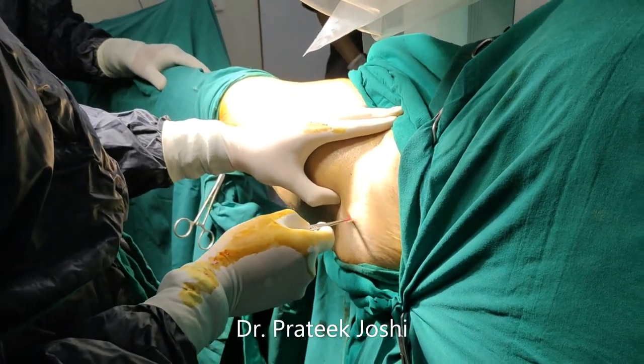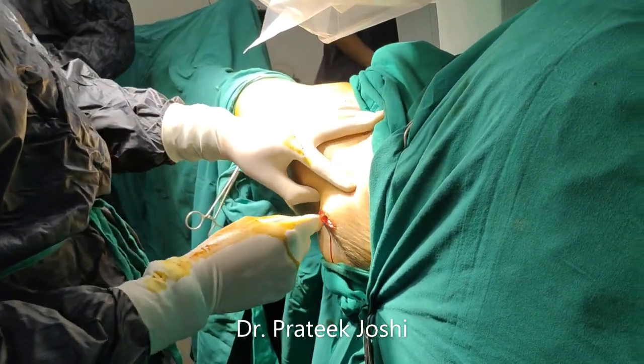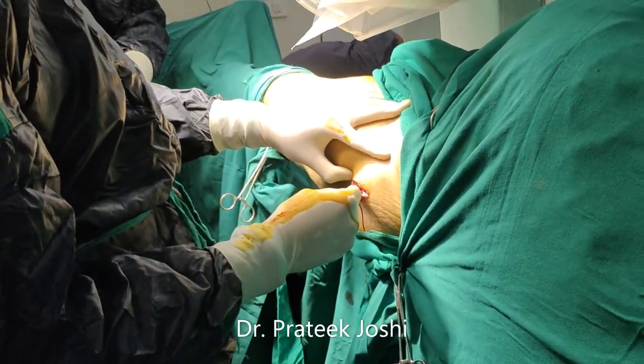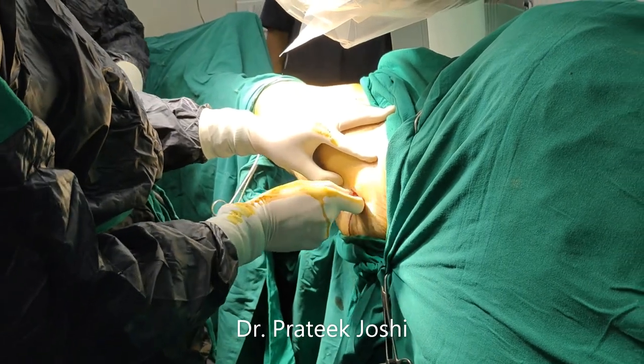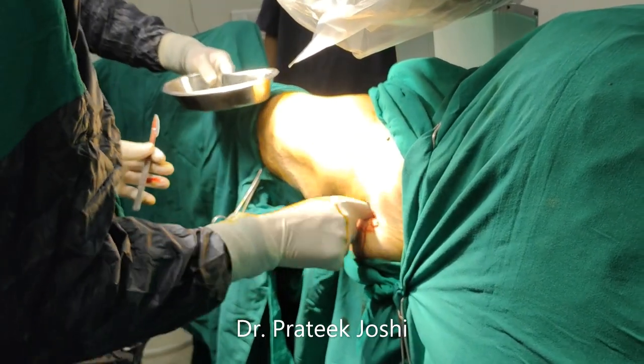Now a skin incision is applied approximately 1 inch superior to the tip of the greater trochanter. Deep fascia and the gluteus medius are split in order to access the tip of the greater trochanter.